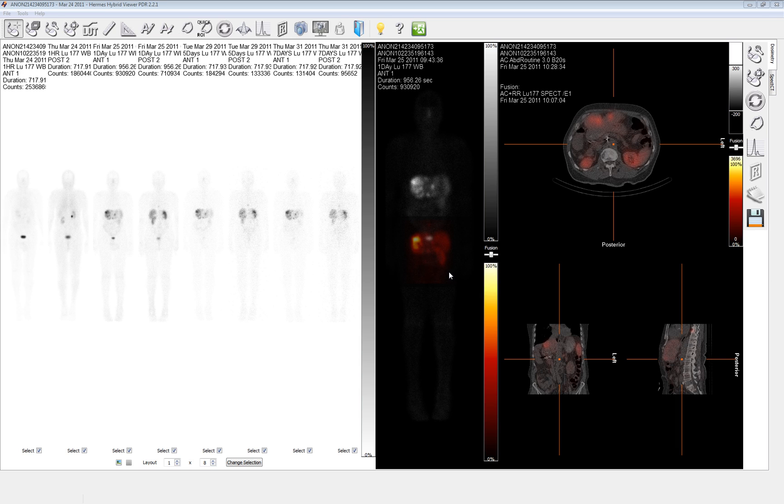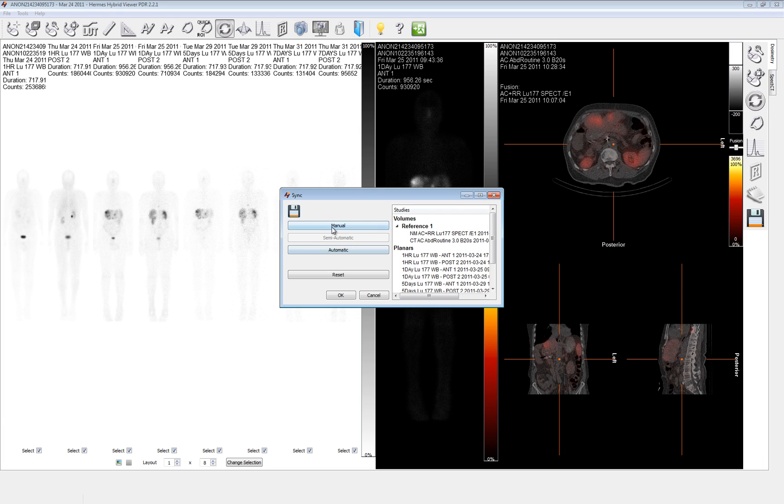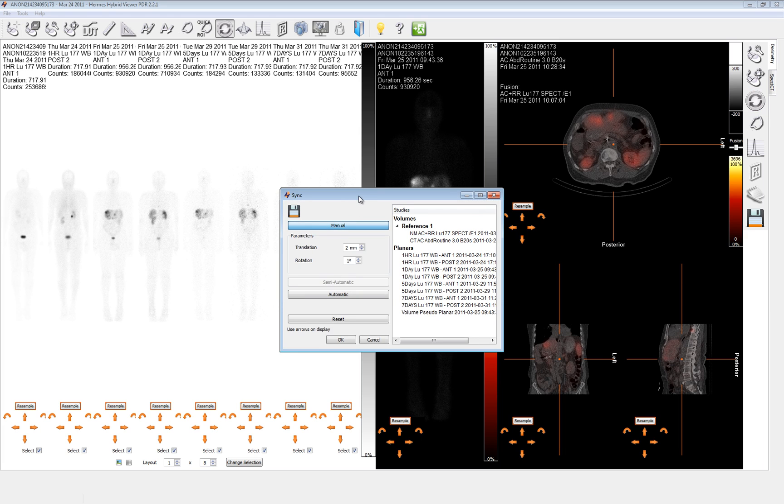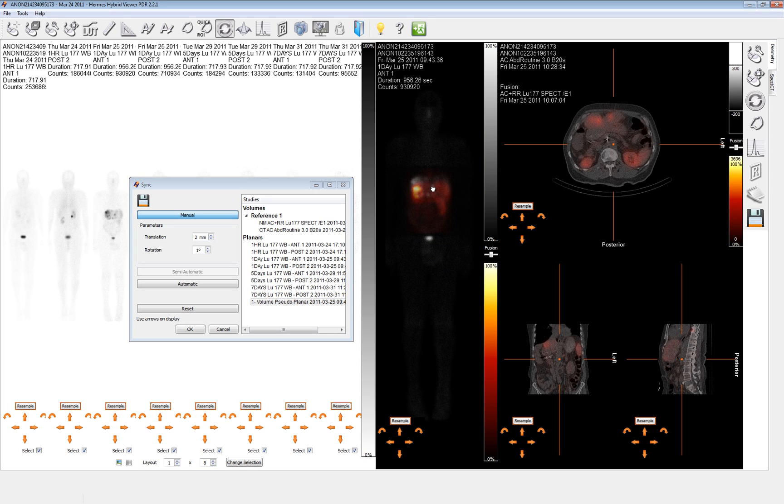Upon loading, the whole body images have been aligned to each other automatically, leaving us with only the alignment between the whole body and the SPECT projection to do. Select the alignment tool icon, click the manual option, and we'll be able to grab the projection and move it into a very rough alignment.